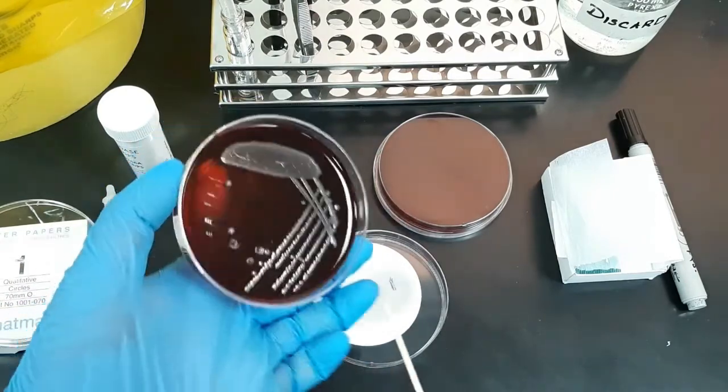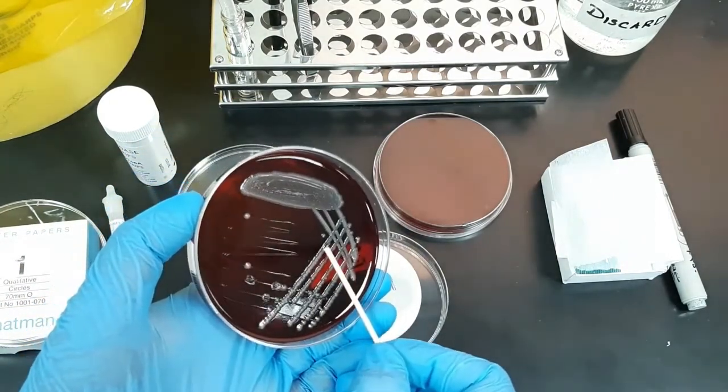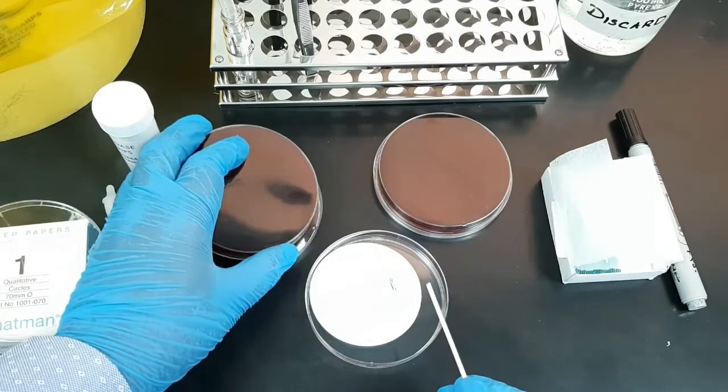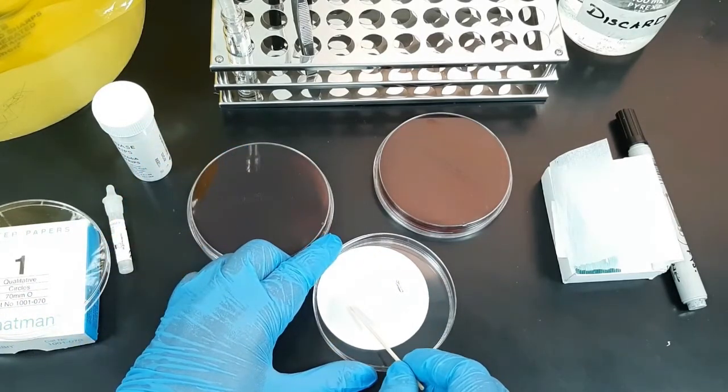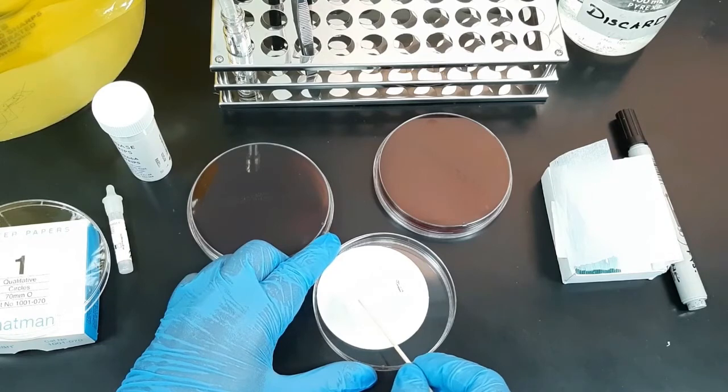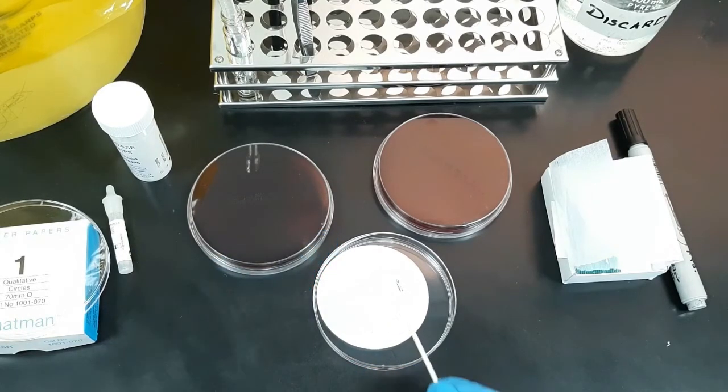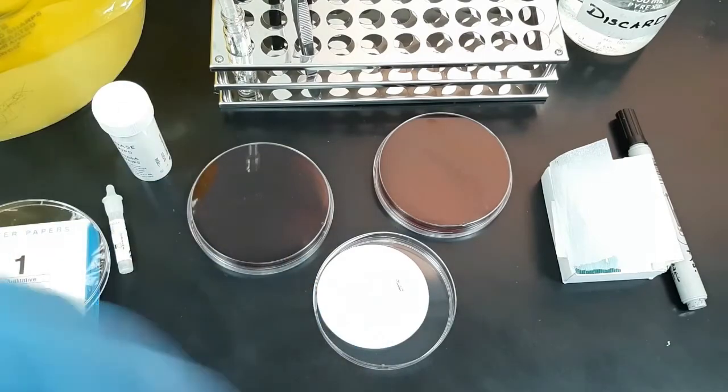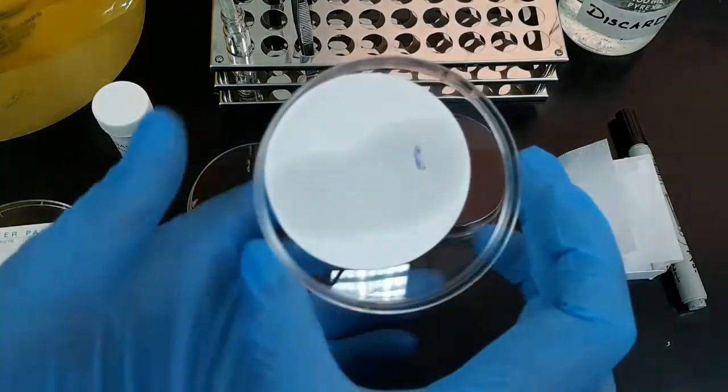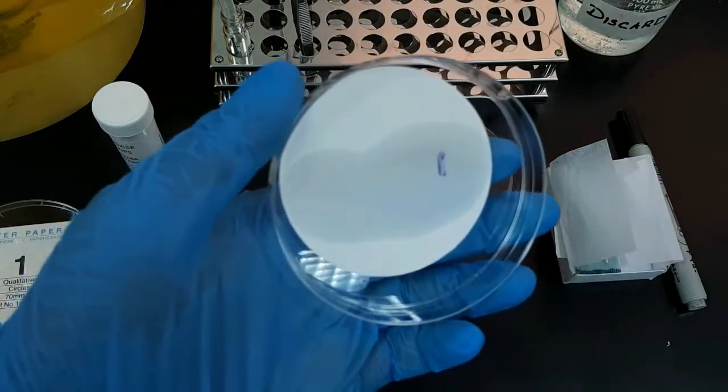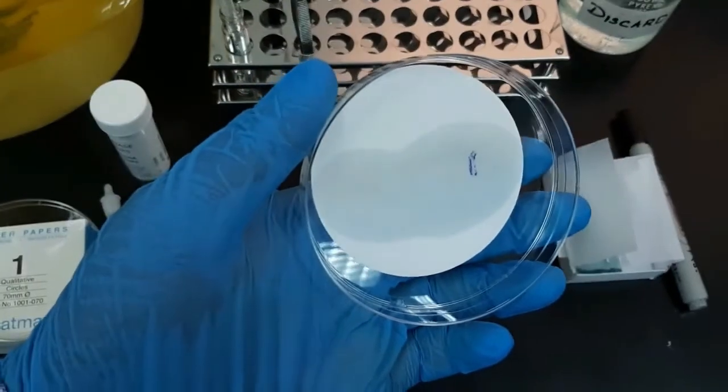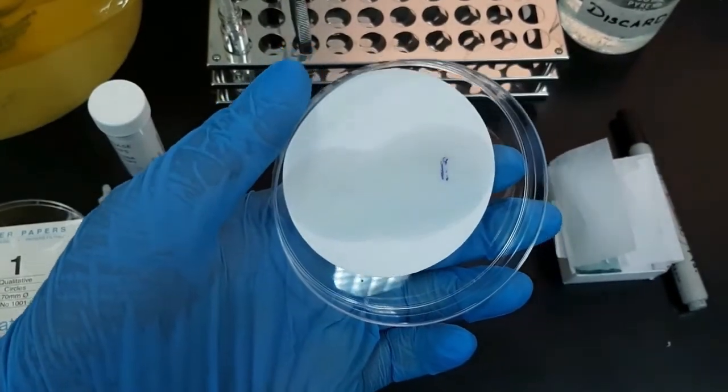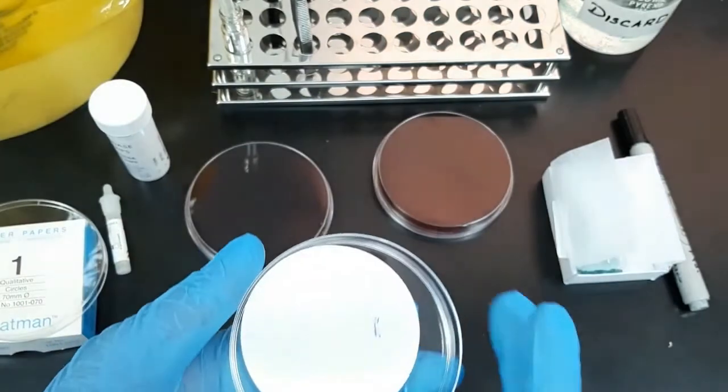Now we are going to repeat the test using an oxidase-negative control on another side of the filter paper. Using a wooden stick, pick the bacteria from the culture plate and rub the sample onto the oxidase reagent on the filter paper. You can notice that there is no formation of purple or blue color in the rubbed area. Now you can compare the positive and negative reactions.